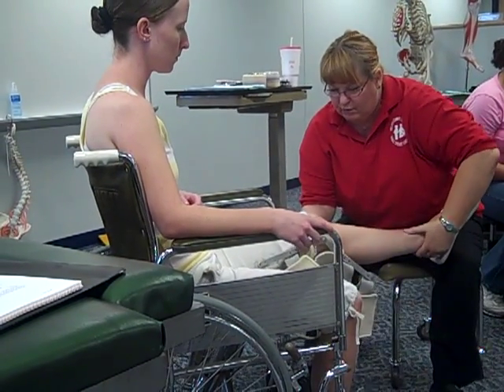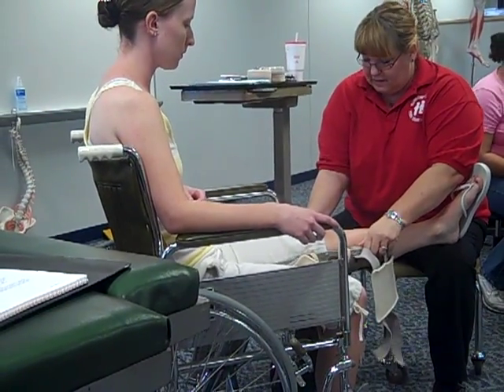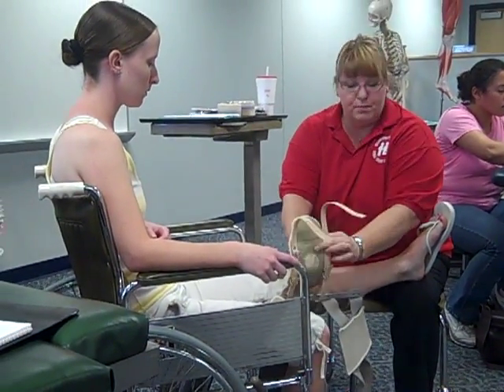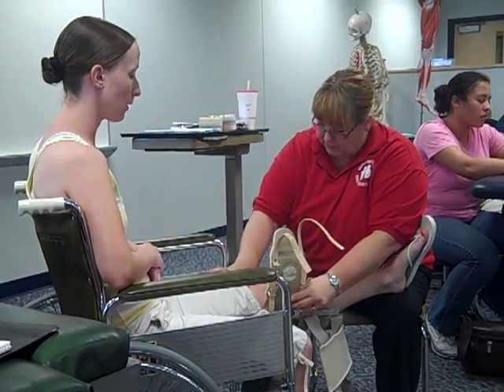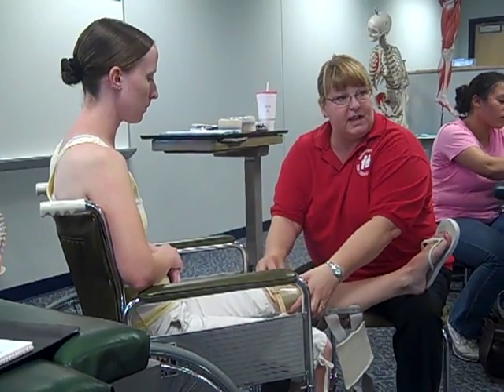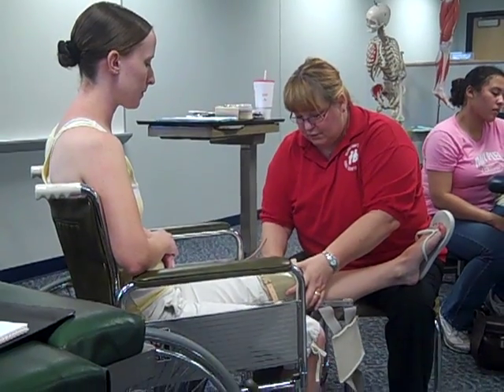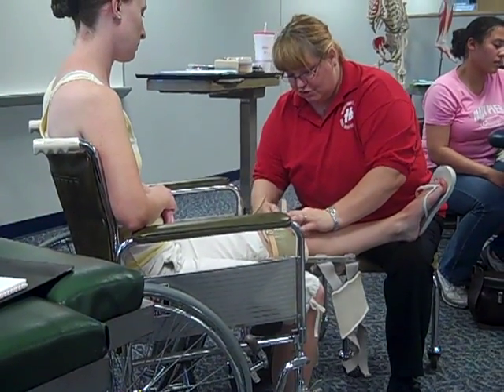I'll straighten her knee right down — relax your leg. Let me lock it up so it stays locked. Once I find it's in about the right place, I'll lock the knee. The first strap I'm going to put on is the knee strap — the patellar part has a soft area that should be centered on the patella. I'll bring her pants up so the fabric isn't in the middle. I need to feel for her patella — I can palpate to find it — and have it centered, then I'll tighten as I go. Let me just get it on first and then adjust from there.